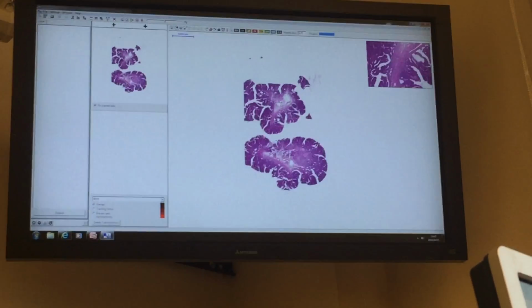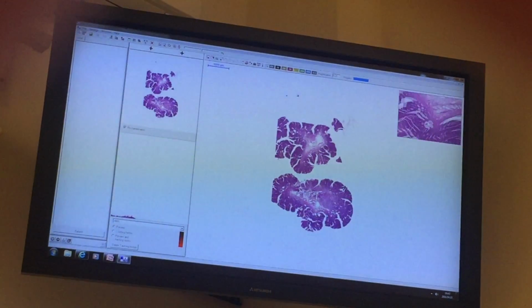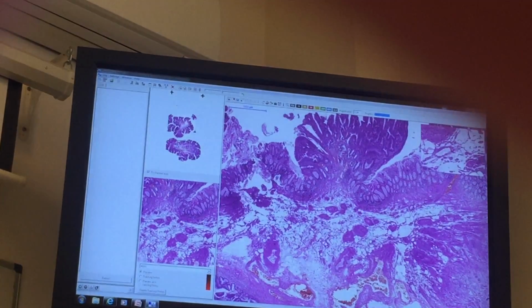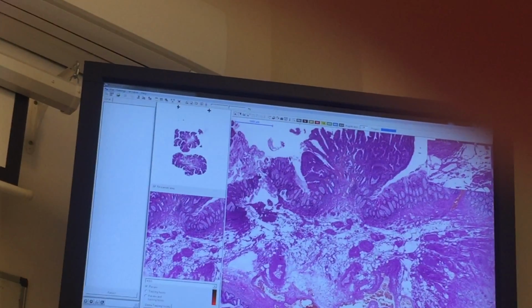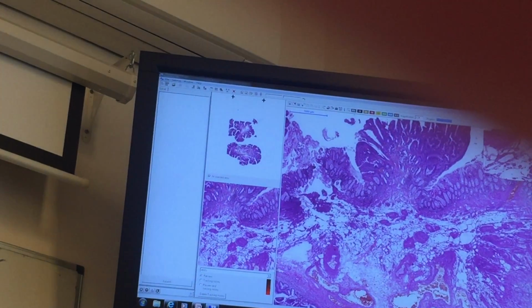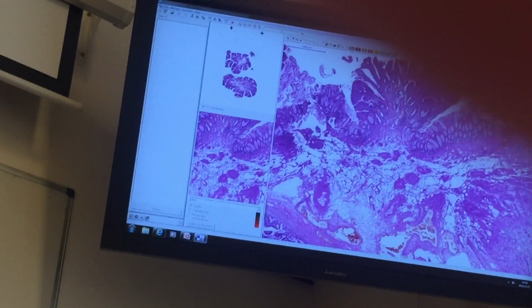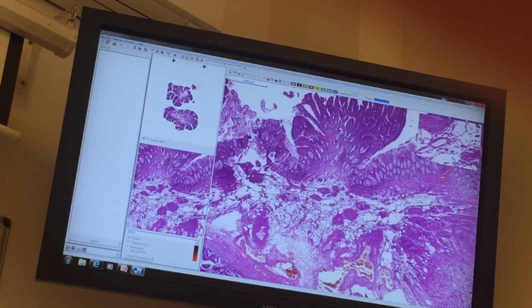These polyps. So on the slide we see one adenoma which is cut in 2 pieces. And let's check this lower one because it's better. Oh yeah, and I forgot to mention something. Like last time we talked about it, even in the urothelial polyps, there are 2 types, the pedunculated and the sessile, like the macroscopic appearance of the polyp.